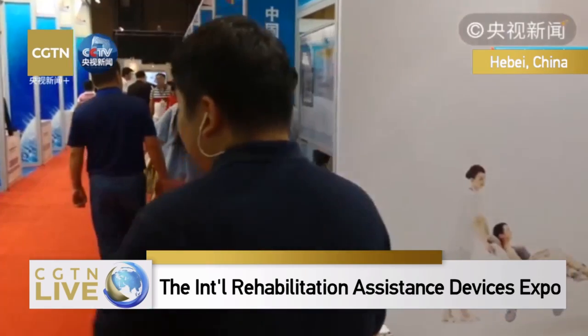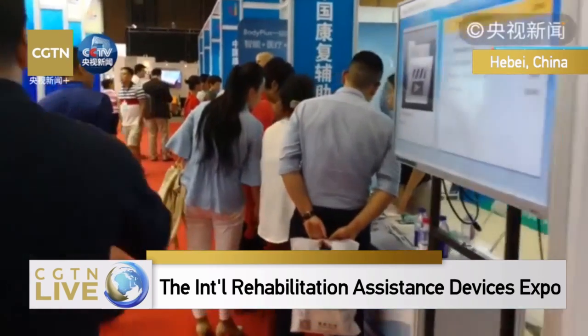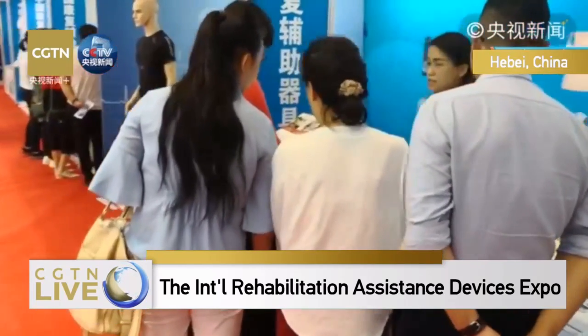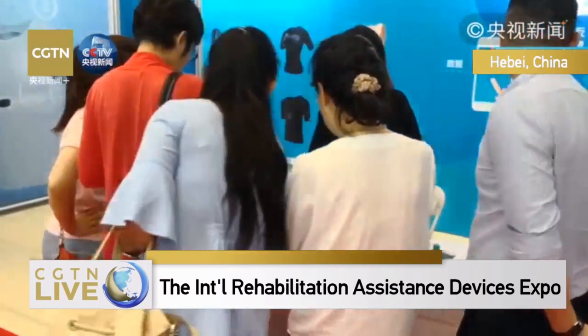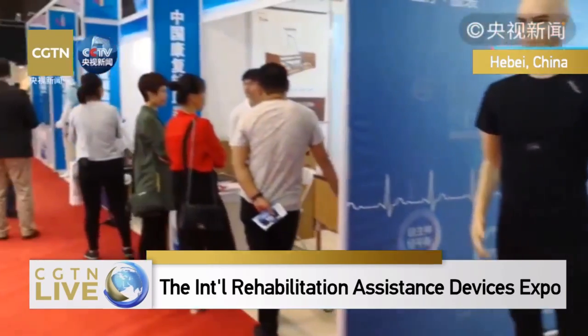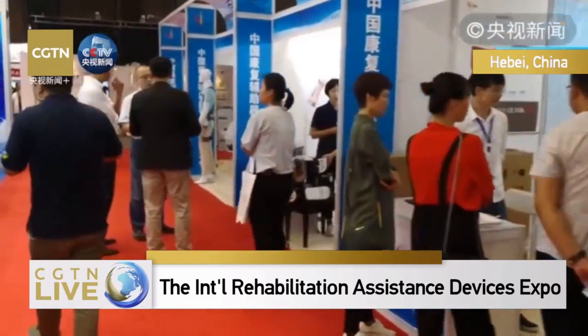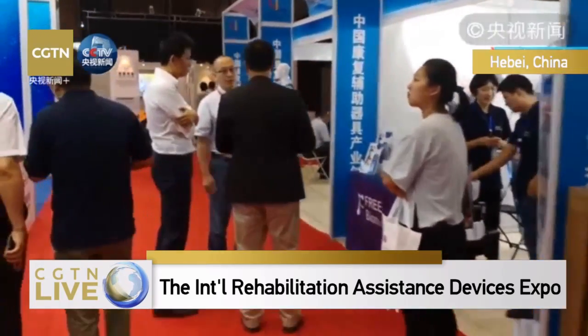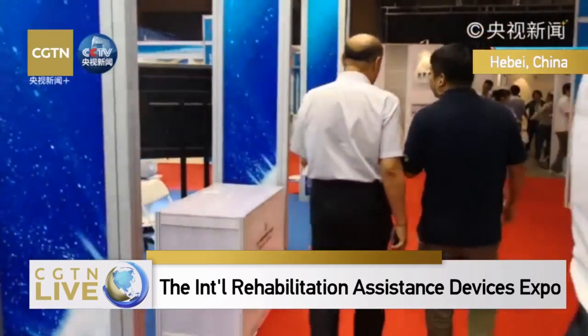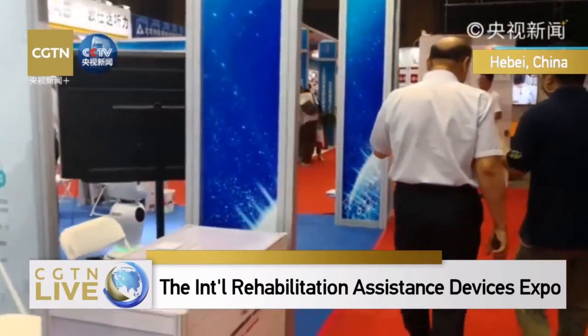In this expo, we have seen a lot of smart devices. Now let's continue to see what they are. These smart devices mainly aim at restoring the mobility of the patient.